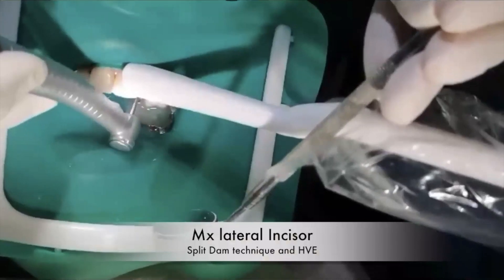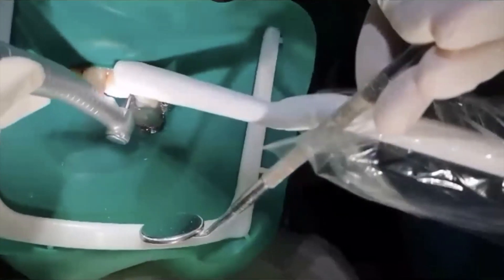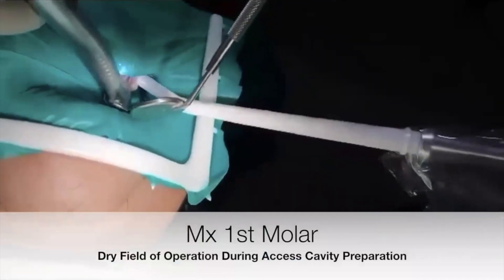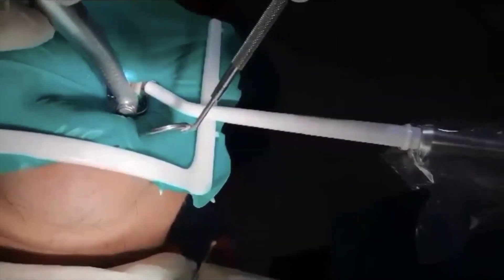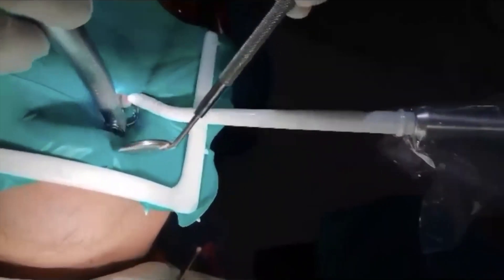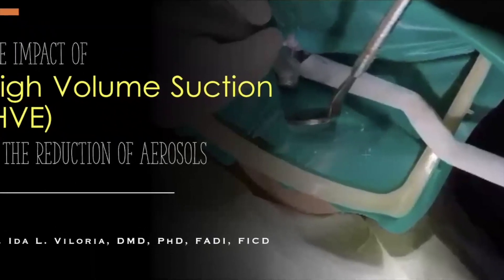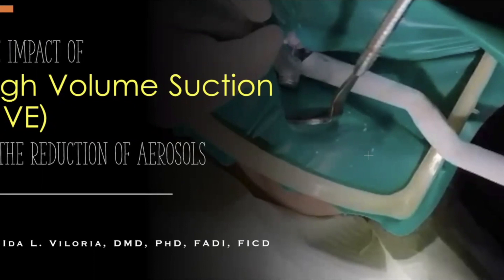The next tooth is the maxillary lateral incisor 2-2, which had a fractured crown, and the tooth was suffering from necrosis with asymptomatic apical periodontitis. On my last case, the maxillary first molar, I did the same thing — the use of HVE and the rubber dam. The purpose of this video is to show that we really need an HVE to catch the aerosols just before they leave the oral cavity, and also to appreciate the role of rubber dam in the reduction of aerosolized saliva.